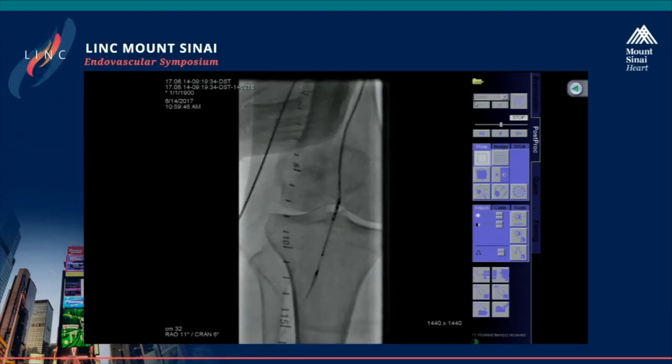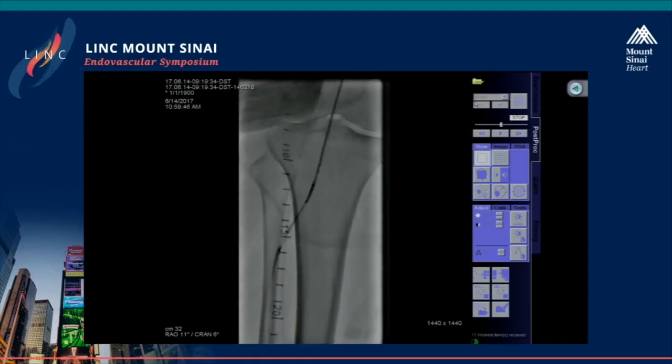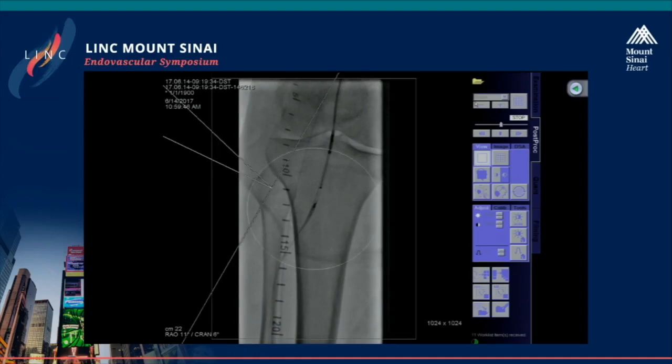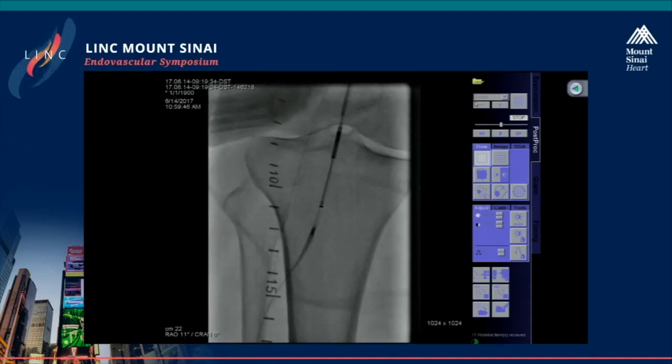And what is this catheter, guys? The HawkOne S catheter. So I'm going to start proximally, and my hope here is to really try not to stent. I wanted to ask the panel what their opinion of DCB in this area is.